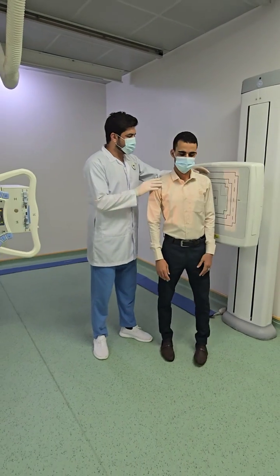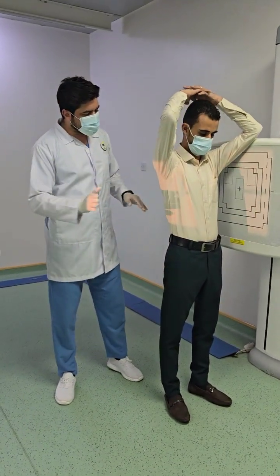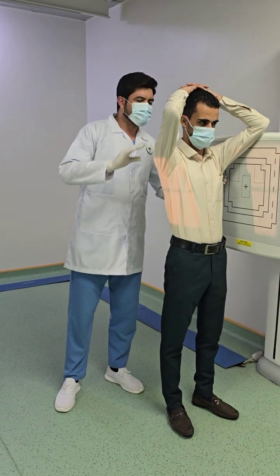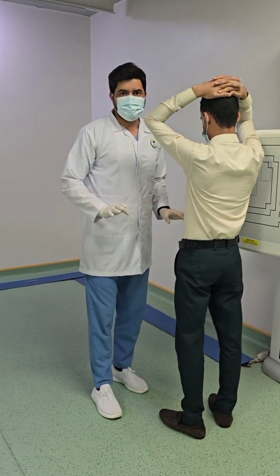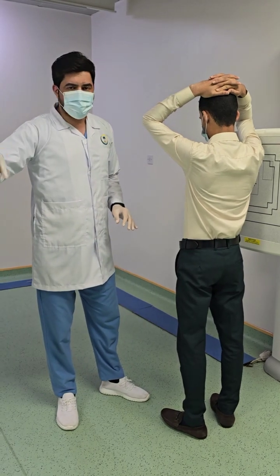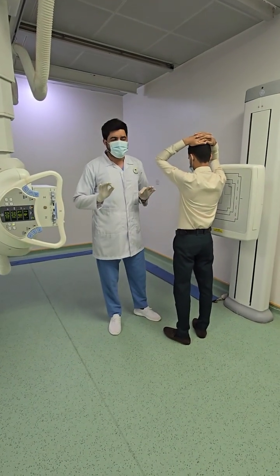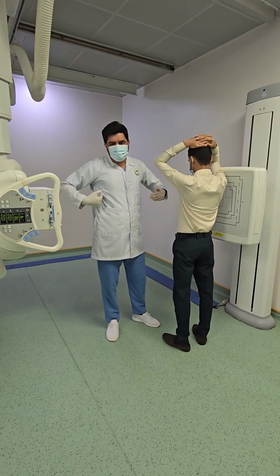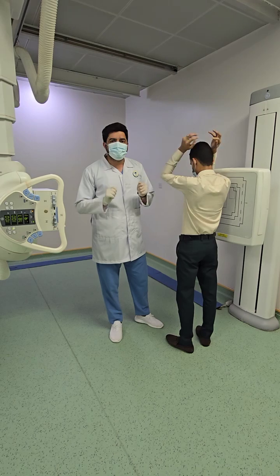In the lateral position, the patient will stand sidewise, either on the right side or on the left side. This is the right side, and this is the left side. See, the X-ray will come out from the X-ray tube and interact at one side of the body, either the right side or the left side. This is the lateral. Now we will come again to the PA.